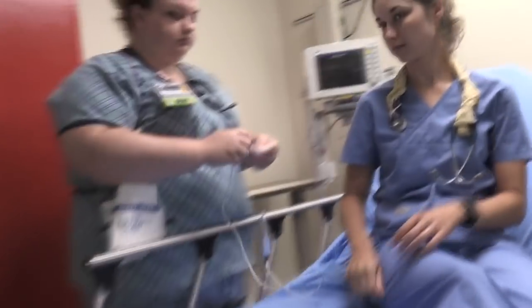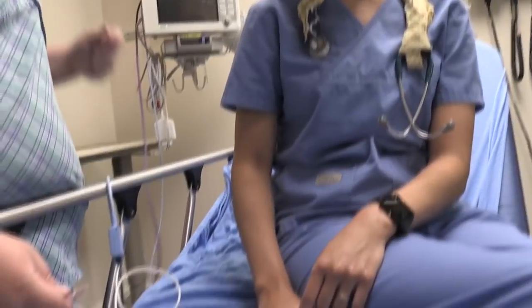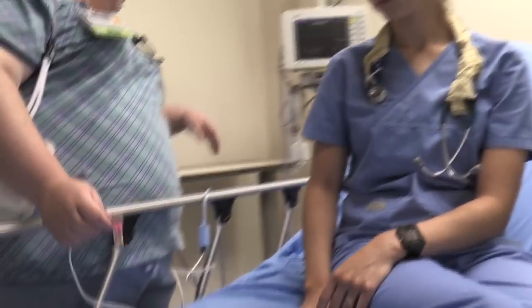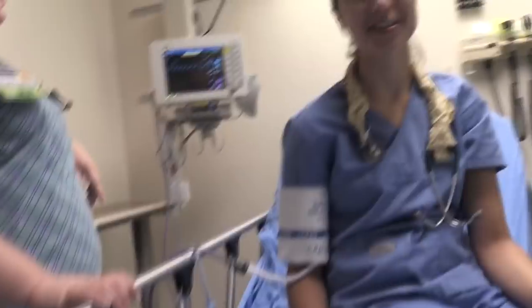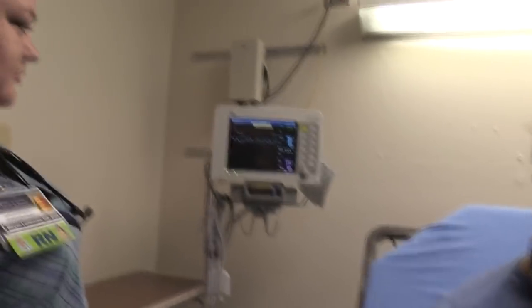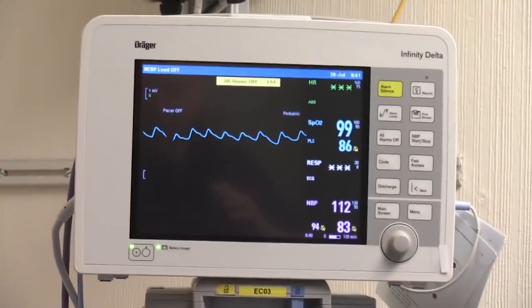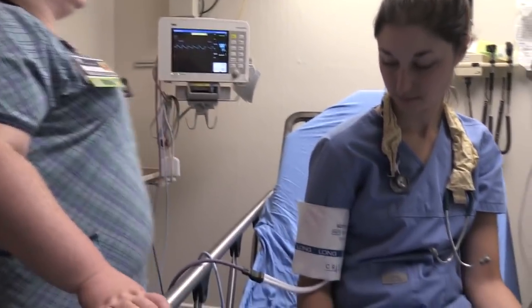Okay, so we are going to demonstrate pulse oximetry and the impact of a blood pressure cuff on the same arm. All right, so we have pulse oximetry on the finger. We've got a good waveform up there. Let me just kind of, good waveform. All right, let's crank up that blood pressure cuff.